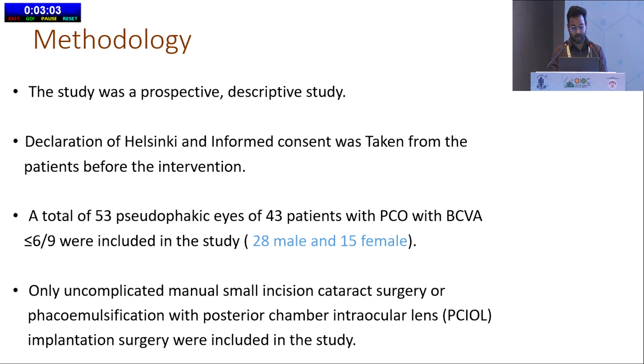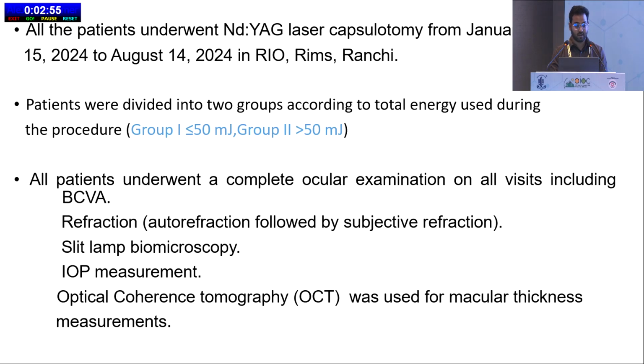Only uncomplicated small incision cataract surgery and phacoemulsification with posterior chamber intraocular lens implantation were included in the study. All the patients underwent Nd:YAG laser capsulotomy from January 15, 24 to August 14, 24 at RIMS. Patients were divided into two groups according to the total energy used during the procedure. In group 1, the total energy exposure is less than 50 millijoules, and in group 2 more than 50 millijoules.